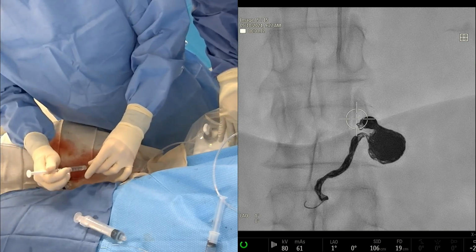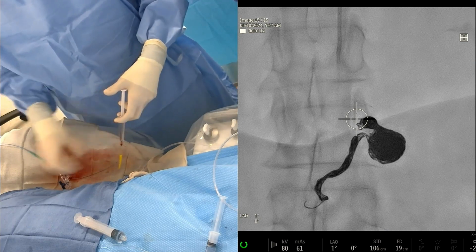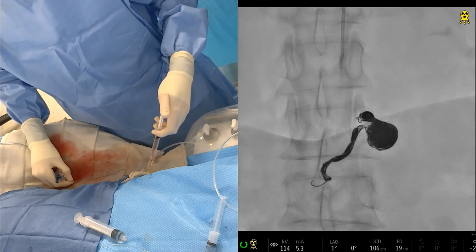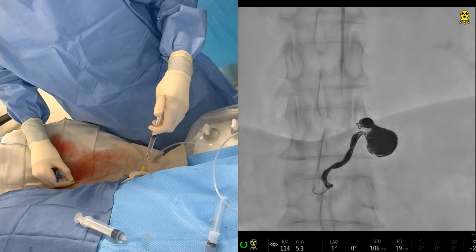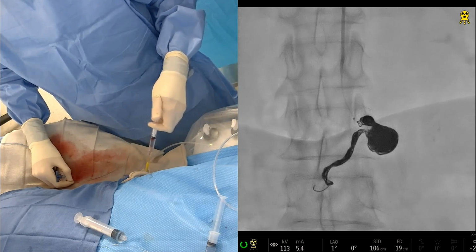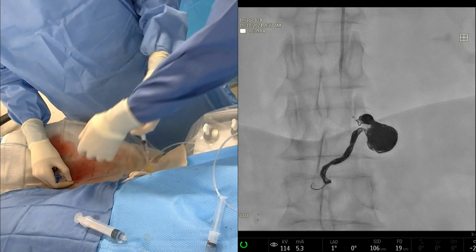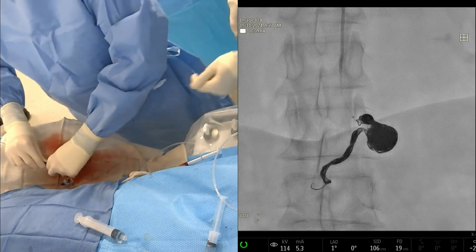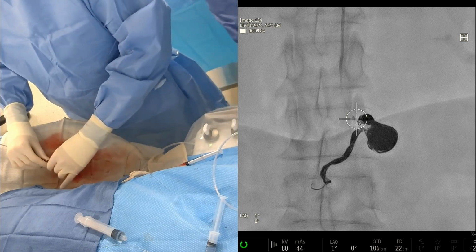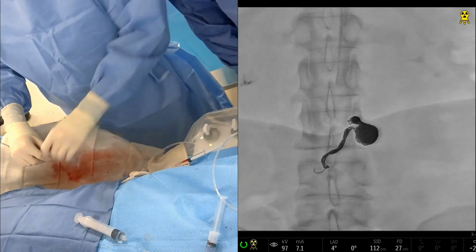How hard was it to cannulate that artery? Was it a challenge to get to that branch, or easy? You could probably just remove the microcatheter and do an angio through the guide. Yeah, that's out. So why don't we just pull it out and do a run? You can also look at it in multiple views to make sure you don't have areas that aren't filled.